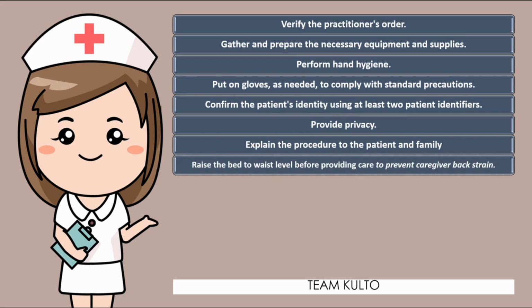Next, raise the bed to waist level before providing care to prevent caregivers back strain. Ayaw mo masyado mababa, bakla. Kung masyado ka nakayuk-yok, o di ba, ang back injury mo, ingat ka, yayaman ka pa. Paano ka yayaman kung meron kang back injury? Proper ROM, range of motion.